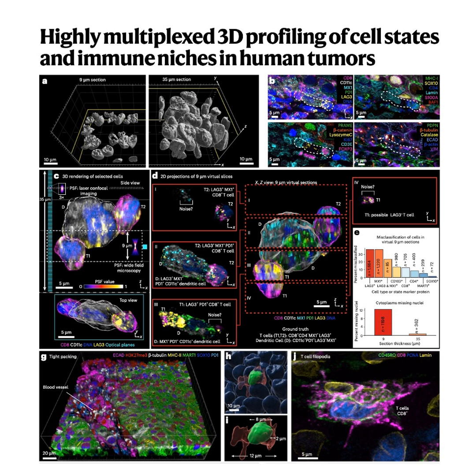It's like going from a blurry photo of a crowd to a high-res 3D model where you can see every individual. And the resolution they achieved is incredible, down to 140 by 140 nanometers in the XY plane and 280 nanometers in depth Z per voxel, per 3D pixel. It is. That level of detail allows us to study cell structure, protein localization, and interactions within archived human tissue, real patient samples, at a level that was previously really only possible with cells grown artificially in a petri dish.